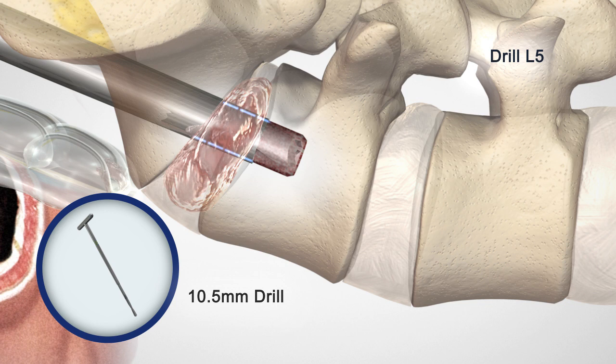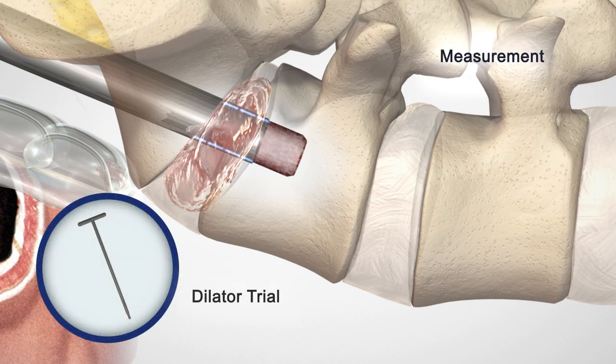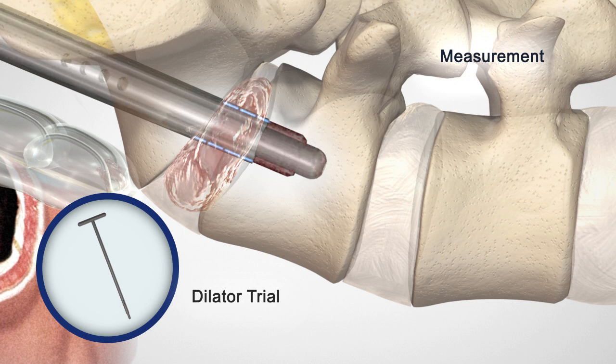Advance the 10.5 mm drill one-third to half way into the L5 vertebral body to allow for the L5 dilator trial insertion. Insert the selected L5 dilator trial into the L5 vertebral body until the shoulder is in line with the inferior L5 end plate. From this placement, the L5 and S1 anchor sizing is determined.